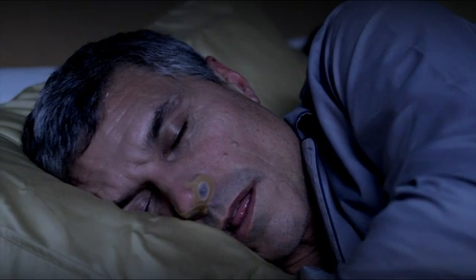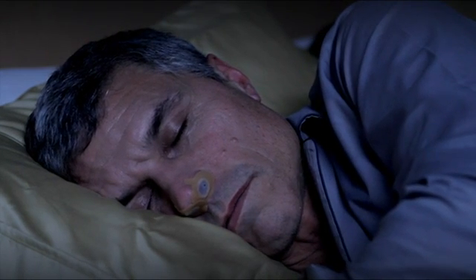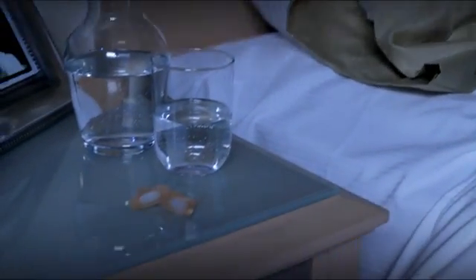Breathe out through your mouth when awake. Do not try to breathe through your nose when awake. This will naturally happen when you fall asleep. If you wake up feeling uncomfortable, just take it off. Try it again tomorrow. It may feel uncomfortable, but give it up to a week or longer. It should get better, and you should get used to it.